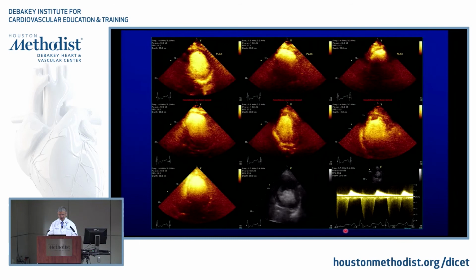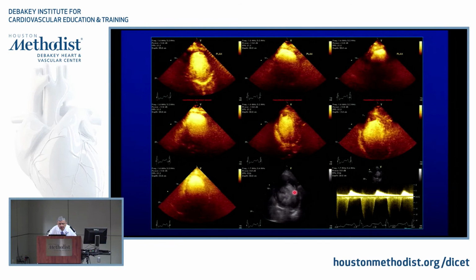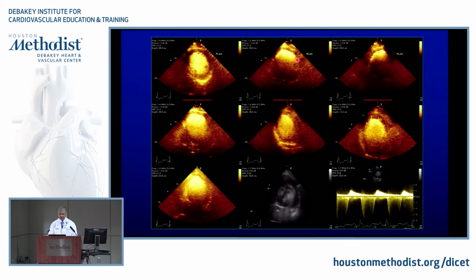And this hurricane is because of? Because of high mechanical index. Let me see if I can find it. Somewhere there, I don't know. High. And what's the other one? What's the other phenomenon? Too much contrast up here. Very bright, shadowing. In the same case.